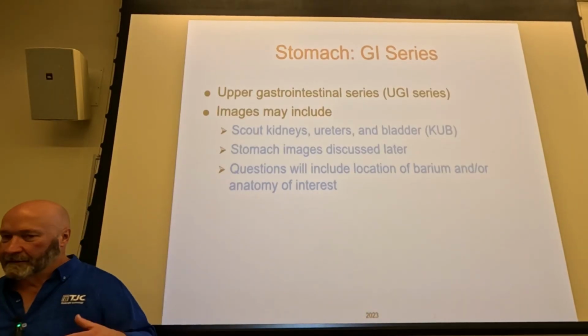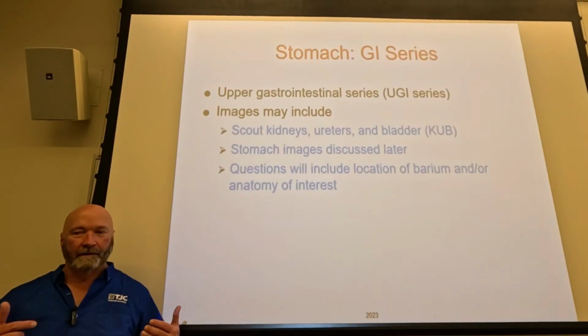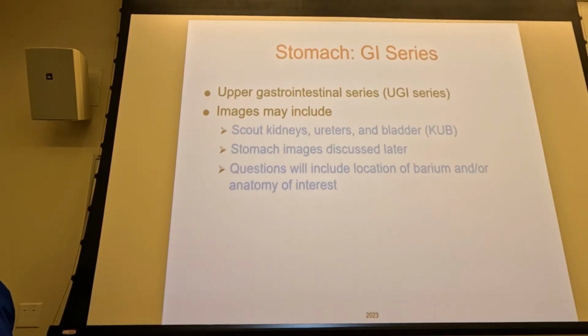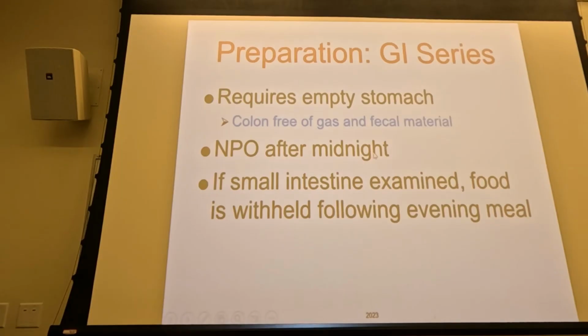And think about the general position of the stomach within the abdominal cavity. Where's the air going to be? Where is the barium going to be? All right, so we start with fluoro, have the patient drink, and so on. Same things that we did before.